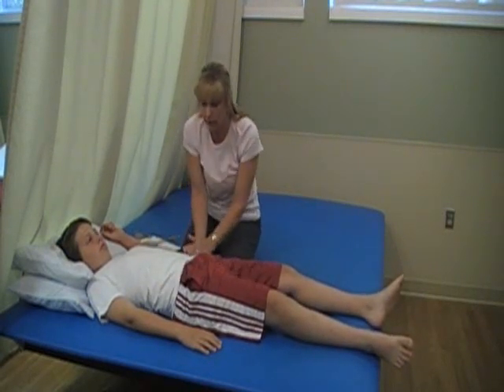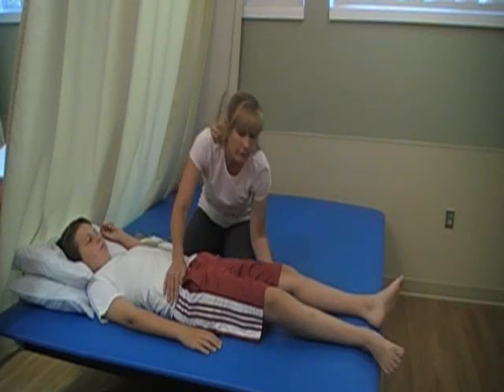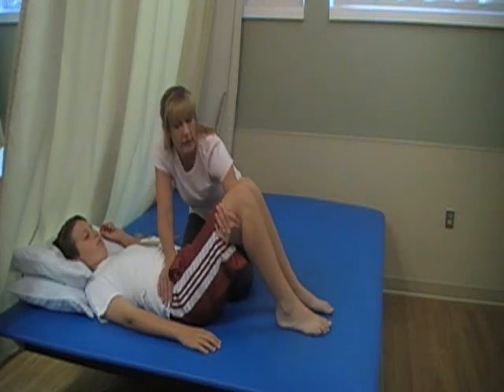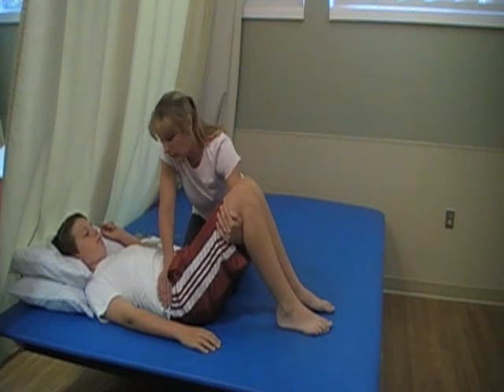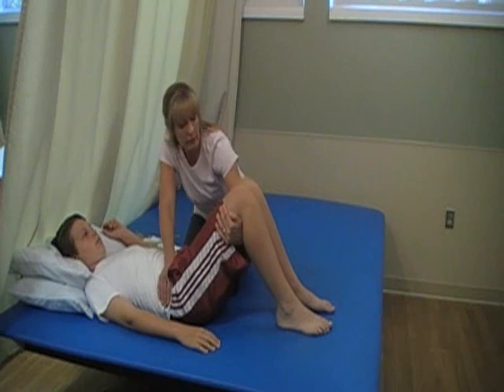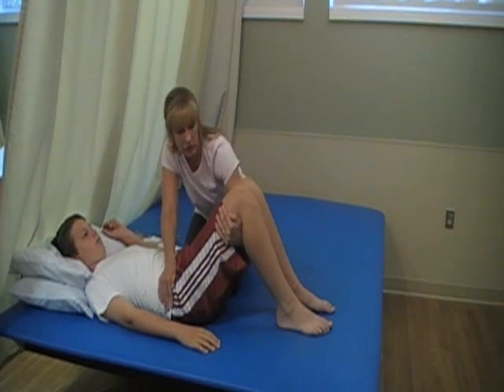So with a hand still somewhere on the pelvis, whether it's on the top or underneath, you're going to begin to flex both of the hips. And it's okay to move the legs together because this is an assessment for seating. So once the pelvis is in an optimal position, as close to neutral as possible, and the knees are flexed, we're going to assess the hip-pelvis relationship.